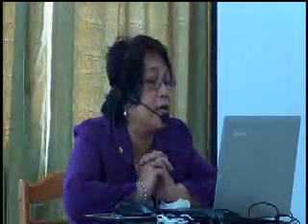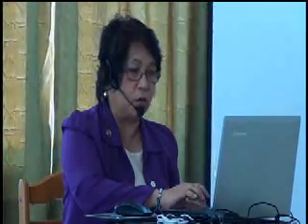Next slide, I'll show you how this is being done. I'll show you a little bit about the concept or principle, and next, how to use it, who is using it, and where you can apply it. So the LFIA concept is this. In the next slide you will see a set of 3 different things. On your left you have the antigen. Your antigen can be bacteria, such as O157, or viruses such as Norwalk virus, and you have this Y molecule. We call this the antibody.